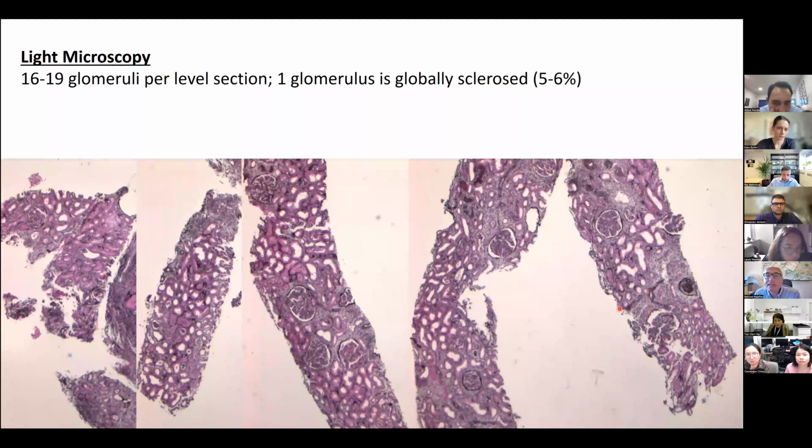And you can see in some areas in this low magnification that the tubules, as in the normal features that Ram described, are expected to be back-to-back, but they are not back-to-back. There is some distance between them. These areas look somewhat black and also with some light areas. So at this magnification, it's a little bit difficult for me to judge the chronicity. So I leave that to our next slide.